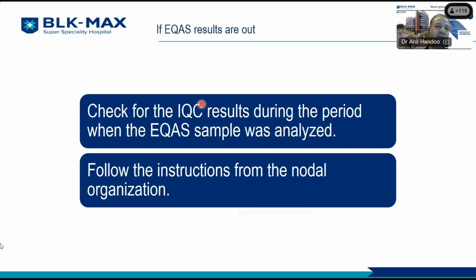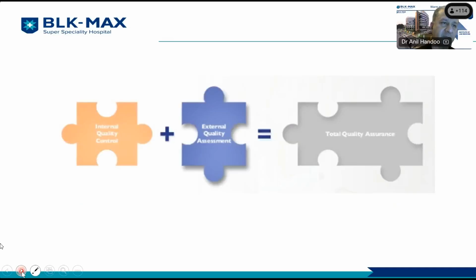And interestingly, when the same samples were run on the three-part analyzer, which was an impedance-based analyzer, those platelet values were actually closer to the values which were expected from the provider. We realized then that the program is not oriented towards fluorescence-based platelet counting. It is oriented more towards impedance-based platelet counting. So choosing your EQA provider is also an important aspect to keep in mind. And when you are not having the right methodology, then please don't run samples in such a state.